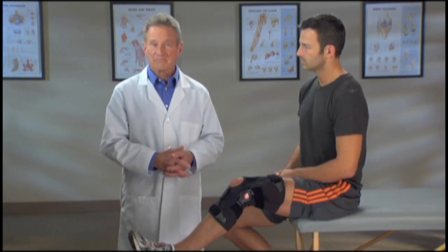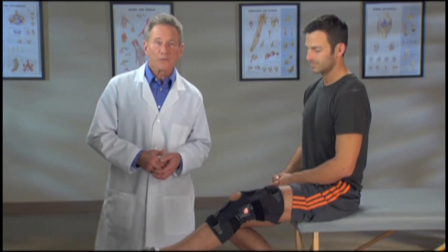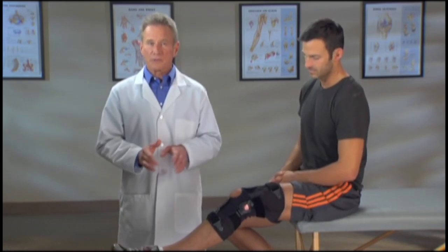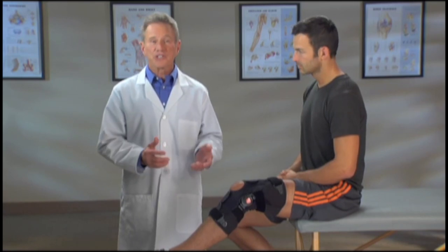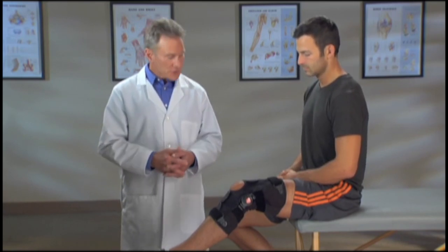Now you're ready to go. After walking around for a few minutes, your body fluid levels will change. If the brace feels loose, you can adjust it by tightening the straps for a snug fit.